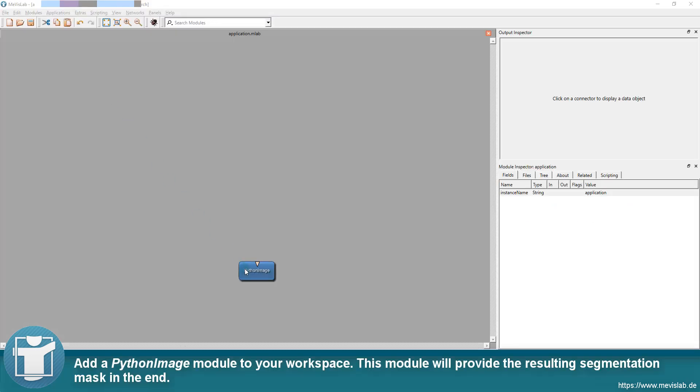Add a Python image module to your workspace. This module will provide the resulting segmentation mask in the end.